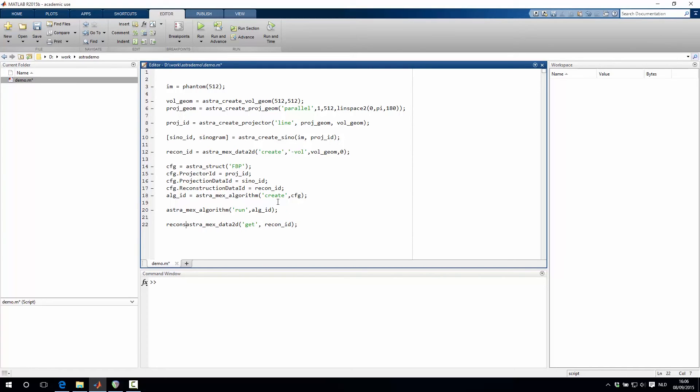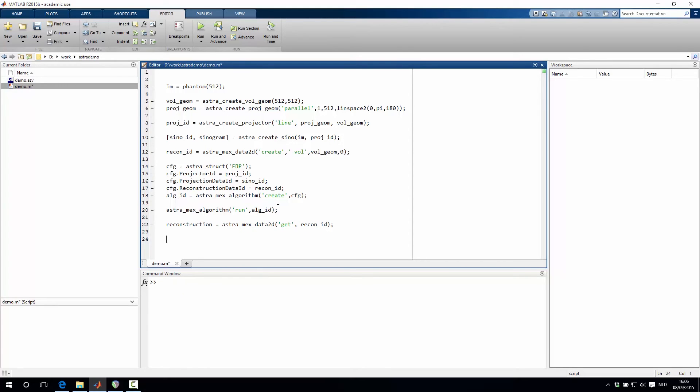And we want to put this then into a MATLAB matrix. And then last but not least, don't forget to delete all the objects that are now in the memory. And this can be done with the function astra_clear. This will remove everything from the memory.